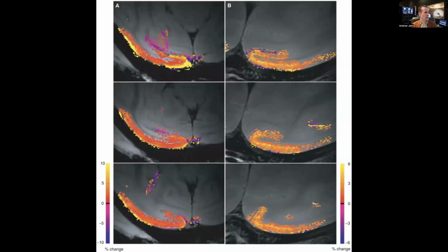Here again, if we focus on things like differences between gradient echo and spin echo, just a brief summary of the difference between them from MR physics. You may recall that spin echo uses a rephasing radio frequency pulse. So you tilt the hydrogen protons, let's say 90 degrees, and there's going to be some random interactions. Some of them are going to start spinning faster, others might be spinning a little bit slower.